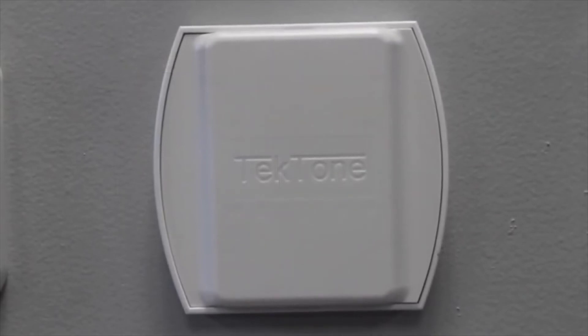Our auxiliary input module provides two dry contact inputs for the system. These can be used to monitor things like door contacts, existing patient wandering systems, or access control systems. They can also be used to monitor anything that will give you a normally open contact.